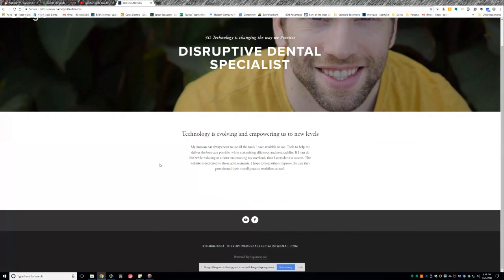Now, do I treat every case with aligners? No, but that's a whole different question. I feel that most cases can be treated with aligners, but there's still, anyway.